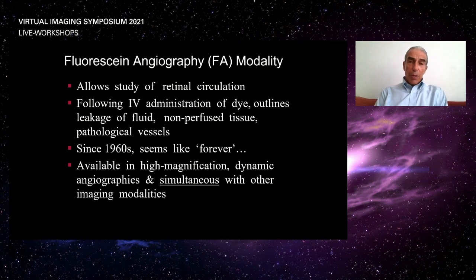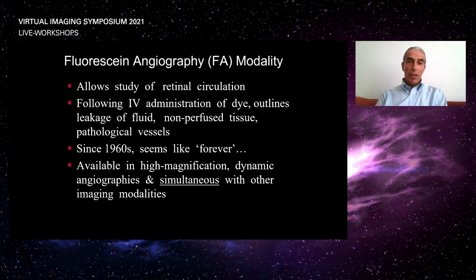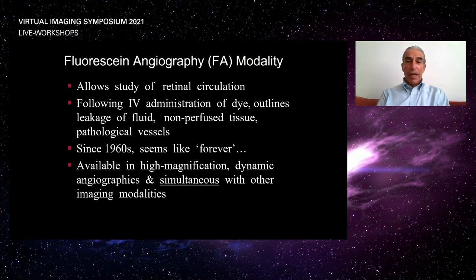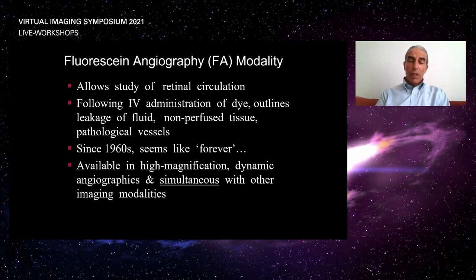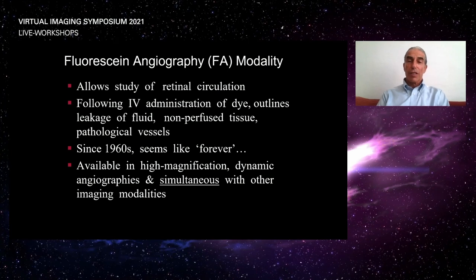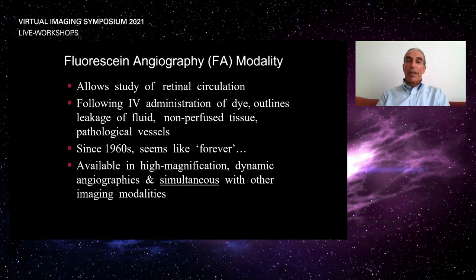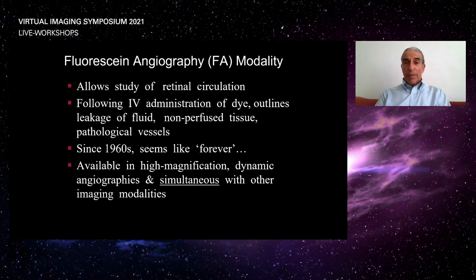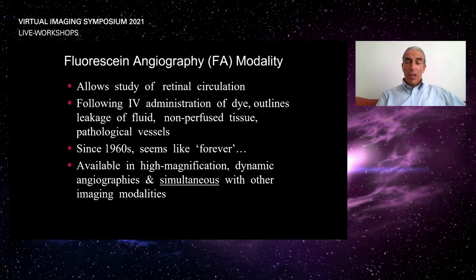Now, next up, we will look at an invasive imaging modality and how that turns out to be multimodal as well. Fluorescein angiography has been here forever; people have been practicing it for 40, 50 years. It was a standard of the industry for many, many decades. It's available in all kinds of applications: high magnification, dynamic angiographies, stereo, peripheral shots, you name it. We started with a very standard 30-degree lens many years ago, turning into wide-angle cameras, variable-angle cameras. And today, we have ultra-wide-field imaging in fluorescein angiography as well.